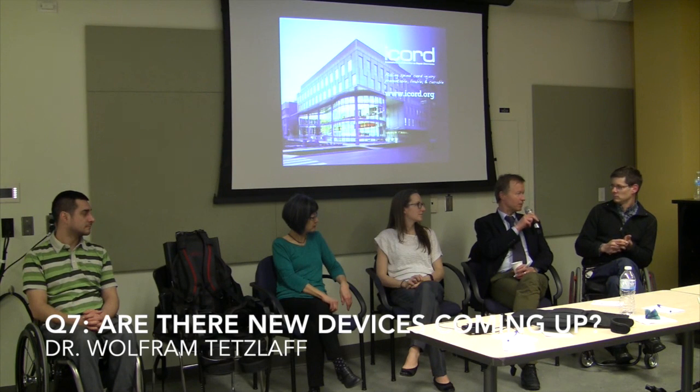I believe there was also one with inbuilt muscular stimulation, electric stimulation of the muscles. That would be the FES, actually. The Indigo does that, but there's also one out of Japan, the HAL exoskeleton, that uses EMG recordings and uses residual muscle function to control the device. So that's yet a sixth one, I guess, and it's out of Japan. I believe it's available in Europe. Not all of these, but three of them at least are available in Europe right now, and so I think there might be a slightly easier regulatory path through the EU than there is in North America. Fewer lawyers, less litigation.